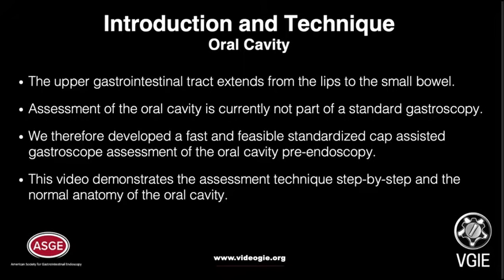Assessment of the oral cavity is currently not part of a standard gastroscopy. We therefore developed a fast and feasible standardized cap-assisted gastroscope assessment of the oral cavity pre-endoscopy. This video demonstrates the assessment technique step by step and the normal anatomy of the oral cavity.